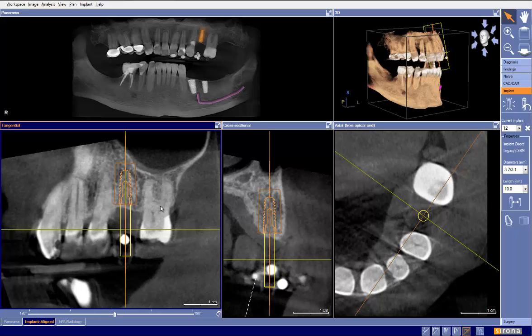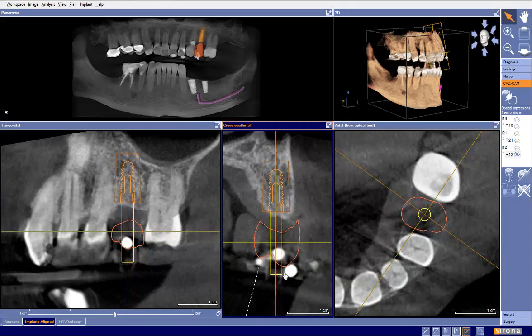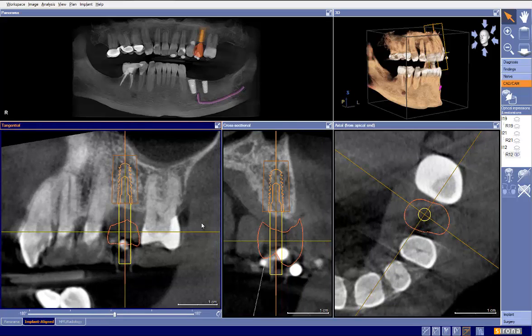So now, if we bring in our CEREC data here, let's go over here to CAD/CAM, and now let's take a look at this. And we can still see that we're certainly better than where we started, but we're not quite where we need to be. And really the major issue is that we're centered very well mesiodistally, but buccolingually we need to be a little bit more like so. So there we go. There's our more ideal plan. And we can take a look.